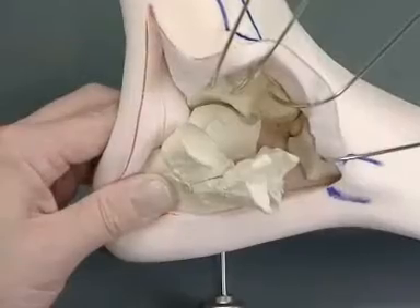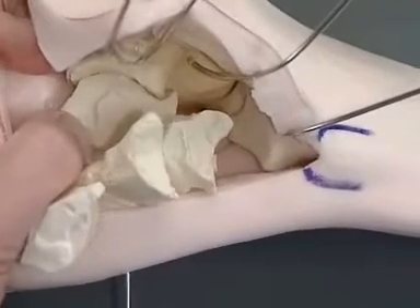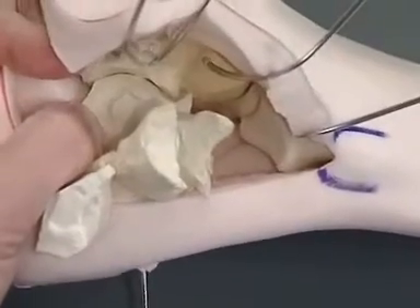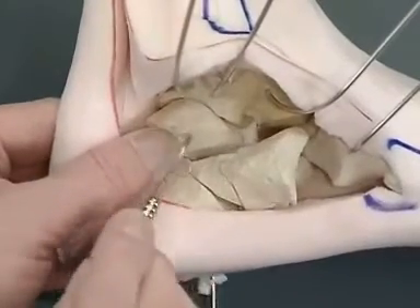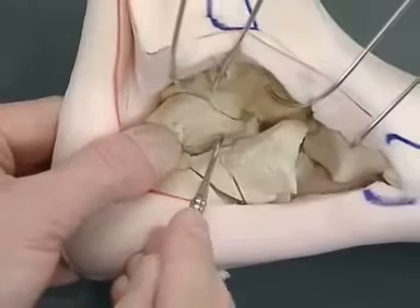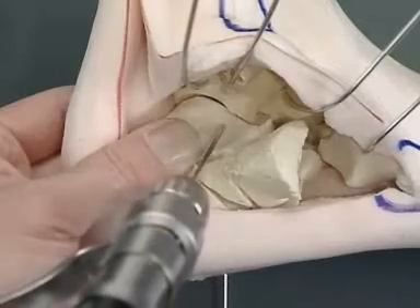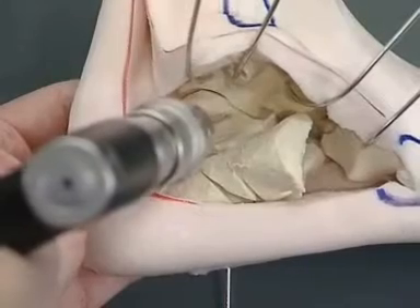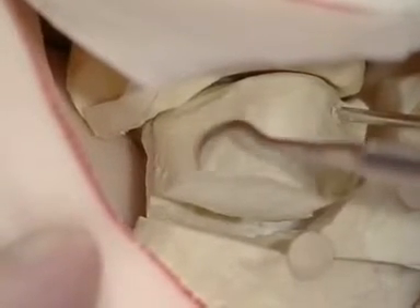The first reduction and fixation are done for the medial part of the posterior facet, fixing this fragment so that it is absolutely flush to the talus using a 2 mm K-wire coming from the medial part of the planta pedis. In the second step, the posterior facet fragment is reduced congruently to the talus and the medial part of the posterior facet of the calcaneus, and fixed temporarily with two 2 mm K-wires. There must be no gap left posteriorly before the second K-wire is positioned, also close to the subtalar joint.